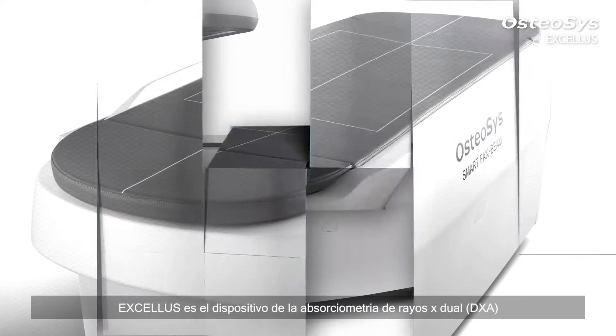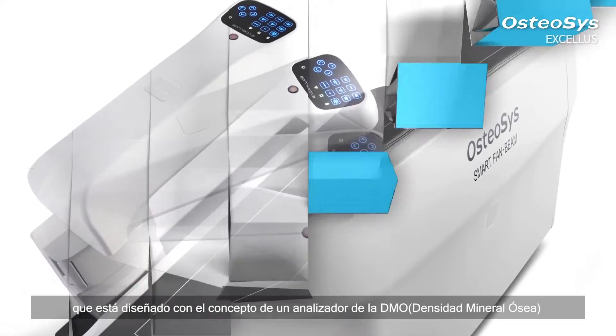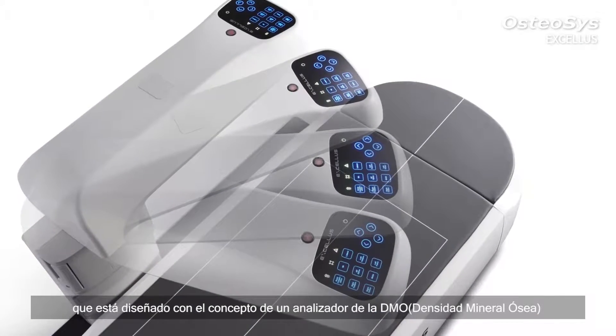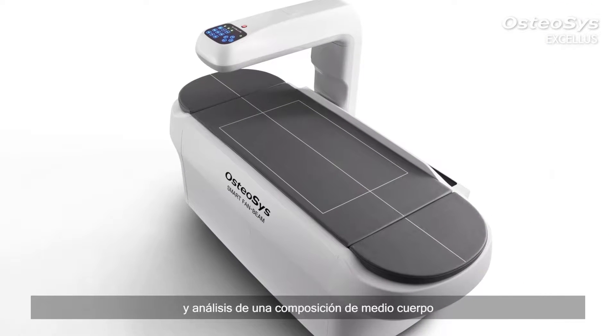EXCELLUS is a half-body fan beam dual X-ray absorptiometry device, which is designed under the new concept of a body composition analyzer, capable of measuring the BMD and analyzing half-body composition.